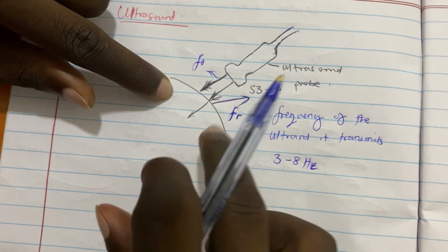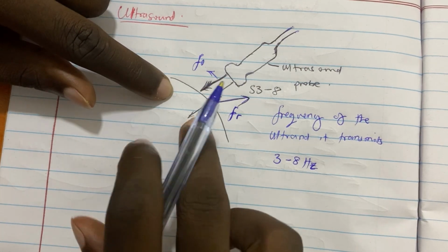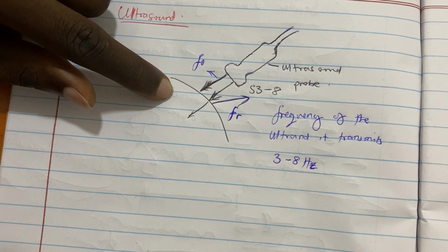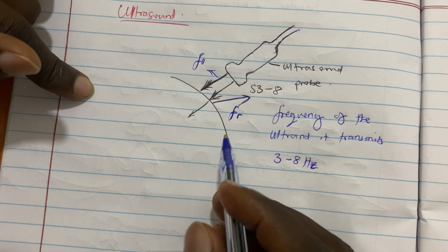This will always happen, whether abdominal ultrasound or echo. This is a property of ultrasound.